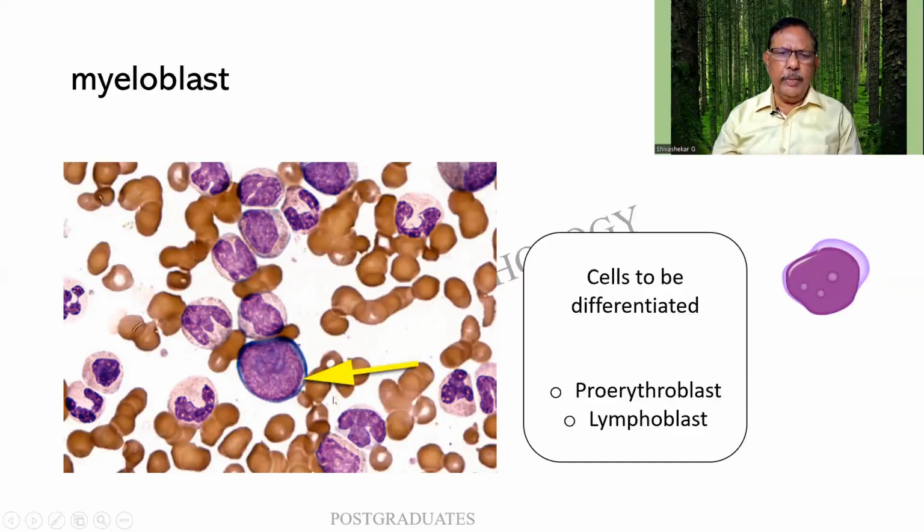In this one, the yellow mark points out to the myeloblast. See these pale areas, and they do not have an outline as such. They are the nucleoli. The chromatin is fairly opened out, and the cytoplasm is there. No granules. So I would like you people to kindly identify the blast. I'm not going into the diagnosis, only the identification of the cell.